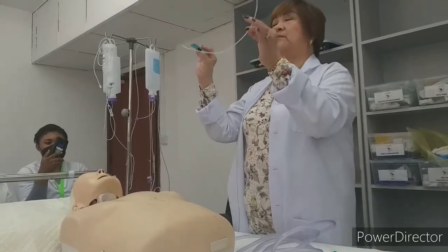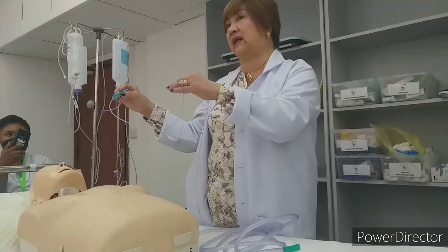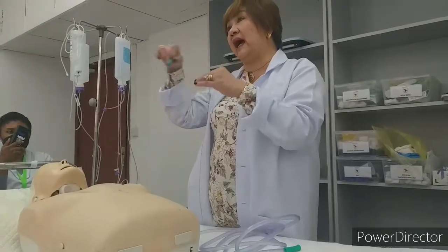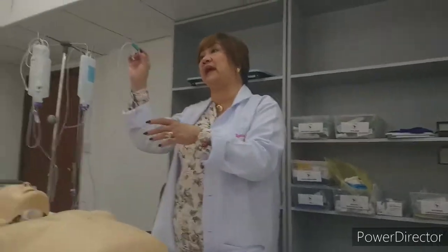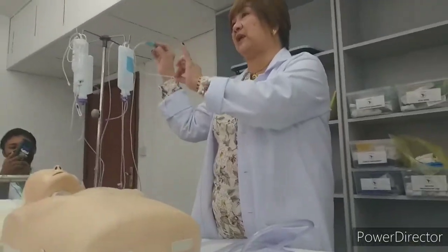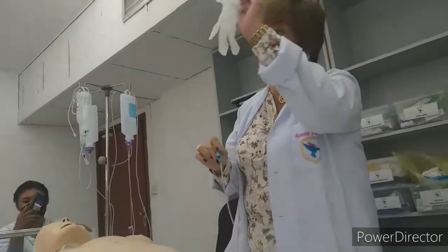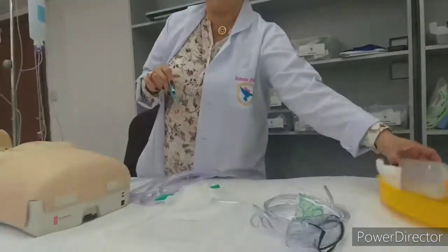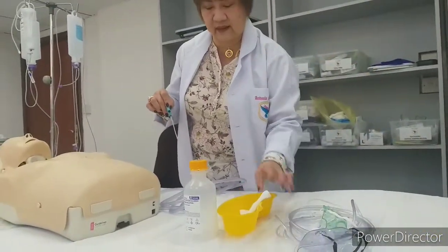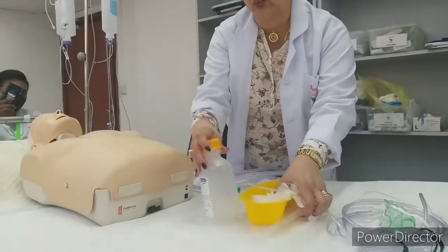Why I said appropriate: for the babies, it will be 6 to 8. For the infant or pediatrics, it will be 10 to 12. And for an adult or elderly, maybe 14, 16, 18, 20. The bigger the size, the bigger the requirement for the elder. So we have the appropriate suction catheter. We'll have a gauze, a bottle of saline, and surely a gauze. So when we come to the patient, we come with all of this.